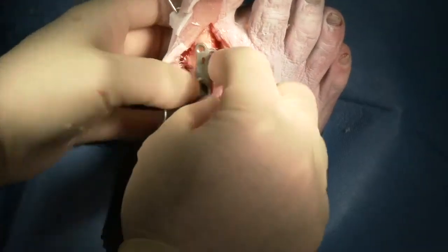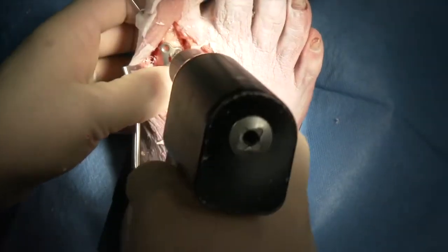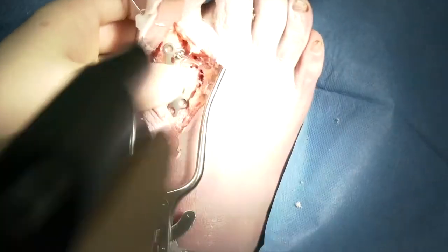Once that's completed, we can place the plate across the joint. We make sure that our distal and proximal screw holes are overlying the bone, and temporarily hold that with olive wires.